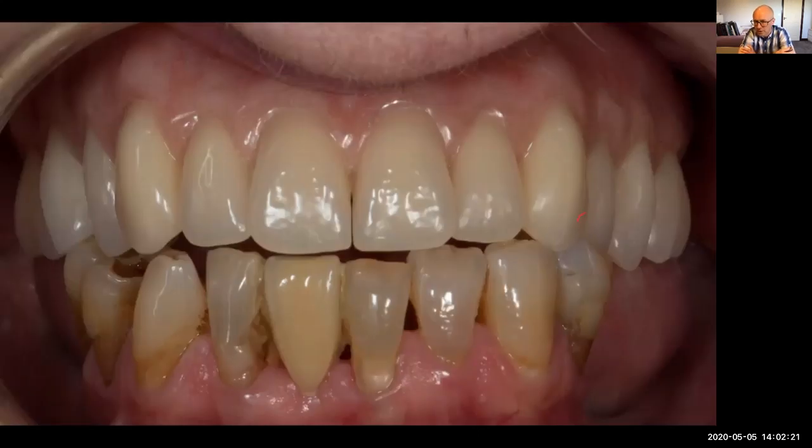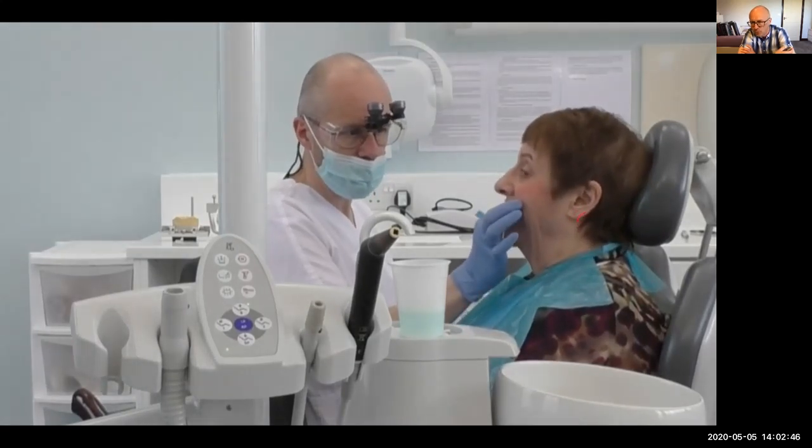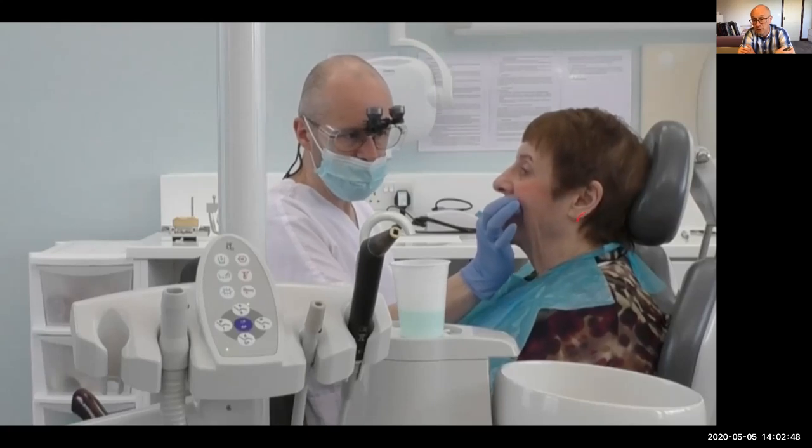Now she's got a slightly shortened dental arch, and so the occlusion, we've actually engineered so she's biting as far back on the denture as possible, to help keep it as stable as possible when she bites together. And it's got fantastic suction, this thing. This is me when I came to fit it. I can hardly pull that thing out. I'm really gripping at it. It's just amazing. It's fantastic. It's really great retention on that.